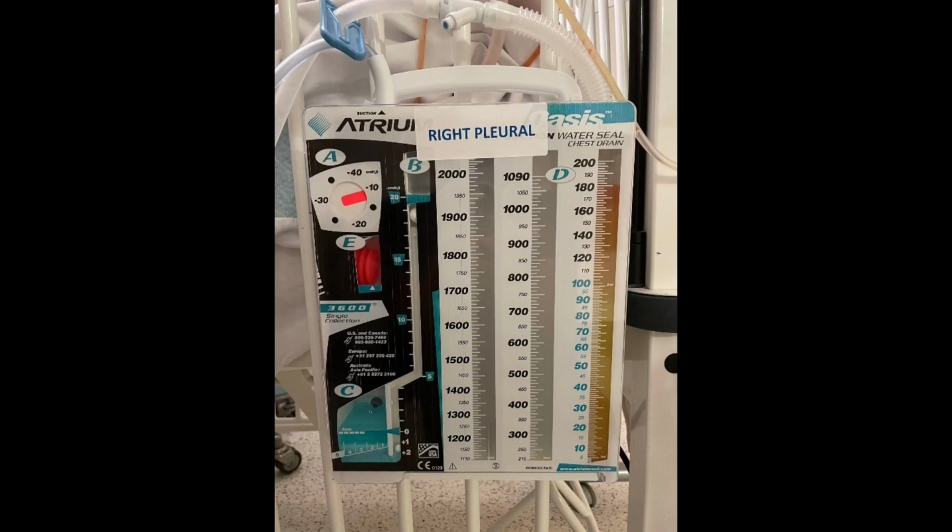As nurses, it's our job to monitor the patient and the chest tube system. Here are key nursing interventions. Assess the drainage. If drainage is bright red and over 100 milliliters per hour, notify the provider immediately. Monitor for air leaks. Bubbling in the water seal chamber could indicate a leak. Keep connections secure. Always check that tubing is taped and properly connected.